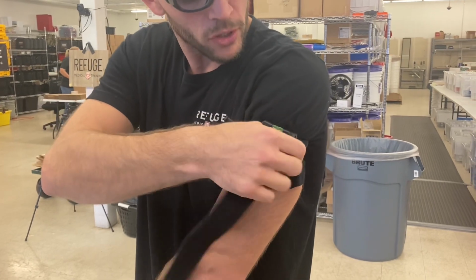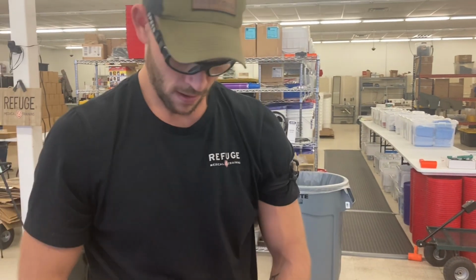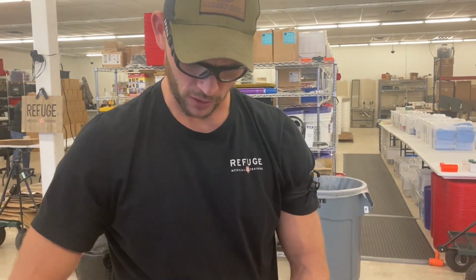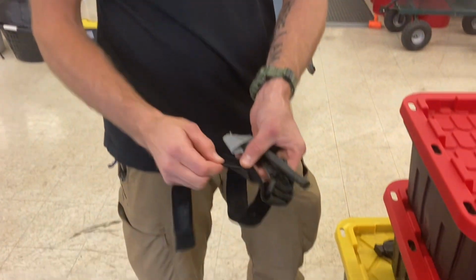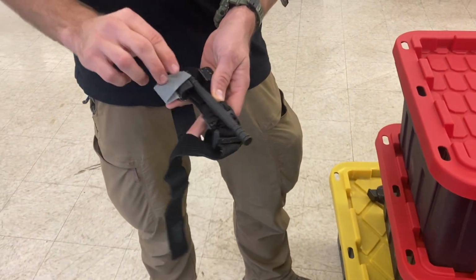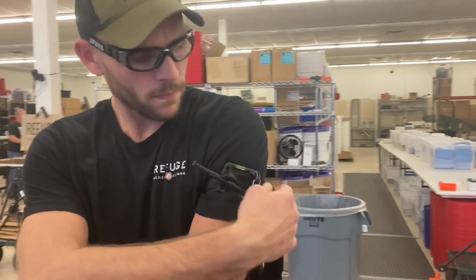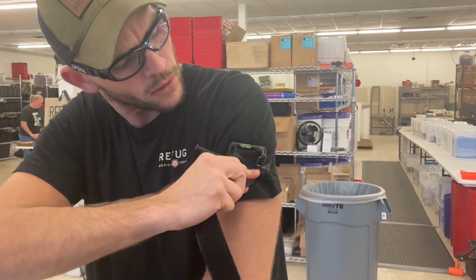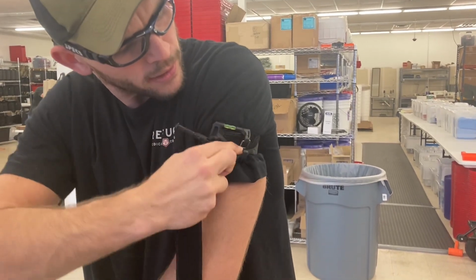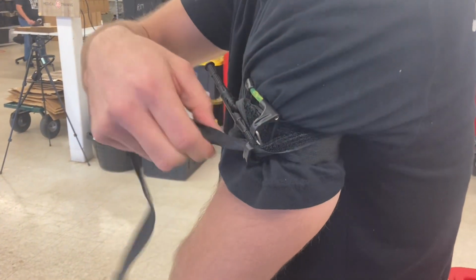Another factor is, what do you do with your strap? Again, in a lot of the trainings, we teach people in my classes that once you have twisted your windlass up real good, it's wrapped around, we want them to take the tail of the cat and bring it back through this clamp and then put the time tab over. It helps pin everything in place. If it's on the leg, you won't have enough room to do that. That's fine. However, on this one, it's not a logical place for me to put my strap, and I actually can't get it pulled to the side enough for this clip to actually do anything.